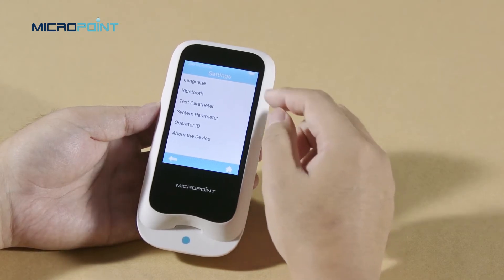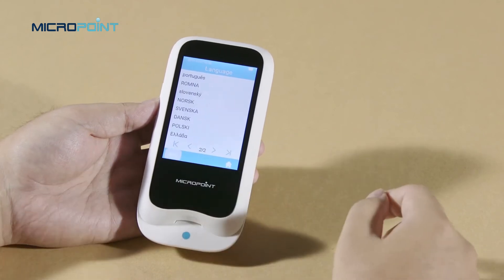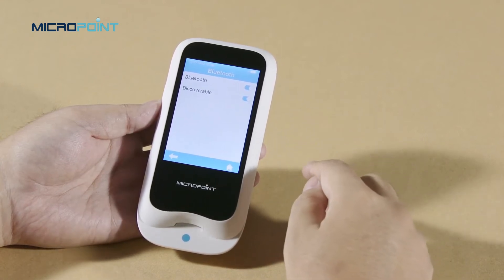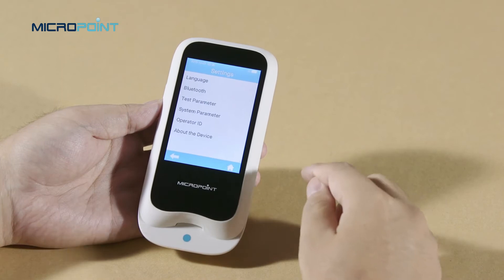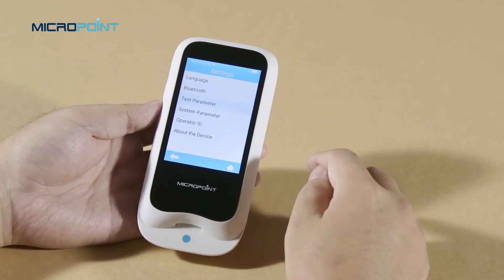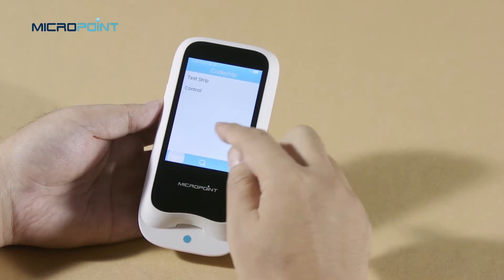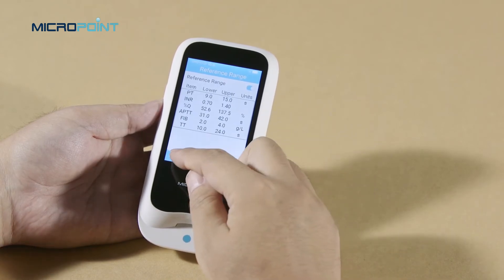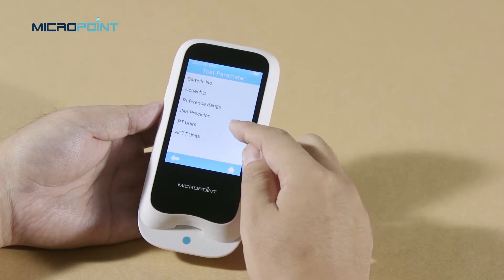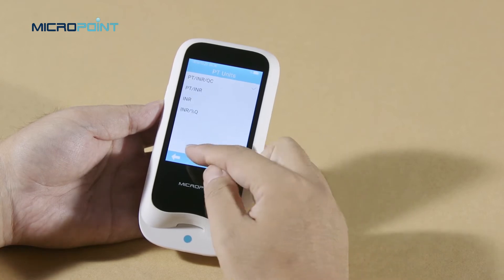The Q-Labs Meter supports up to 16 languages. Bluetooth can be used to connect the meter to E-Station 2 and a specific mobile app to upload or print results and upgrade. In the test parameter, you can set the sample number, review the code chip list, and change the reference range, which is used to alert the user when INR results are out of range, and set the INR precision, PT units, and APTT units.